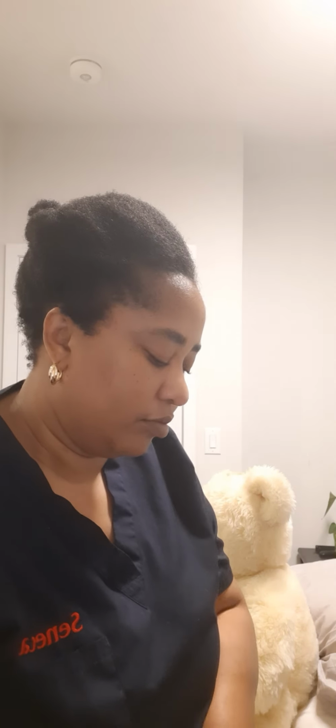This is the scan of the room. Okay, so I'm going to start first by washing my hands. Then I'll be donning my gloves. And I'll be wiping my stethoscope.